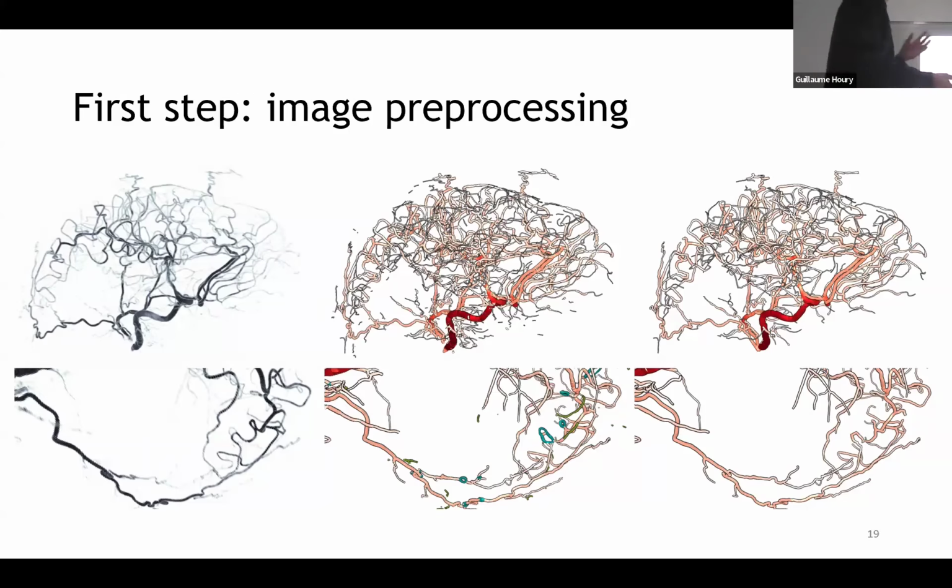But in our case, our data is sufficiently high resolution for this preprocessing to work with quite simple algorithms. So that being said, I will just assume now that we have already done this first preprocessing step, and that our input takes the form of a tree already.